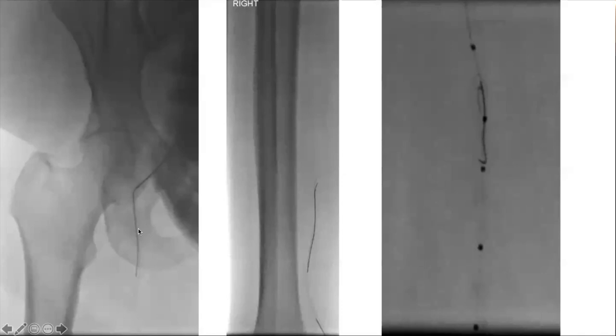This patient tried to go down with the catheter and wire support but didn't make it, so had to go retrograde — which is why having the foot prepped is very helpful. This is accessing the anterior tibial, and you see the micropuncture wire — again a Nitrex wire. Eventually, as you can see in this picture, there's a support catheter from above: an 0.018 Quick-Cross with an 0.018 wire, and from below an 0.018 support catheter with a micro snare. Me and my partners use micro snares — these are 4 mm snares — as a target, whether we're trying to grab a wire or targeting with an Outback. We like to use micro snares; they can be really helpful.